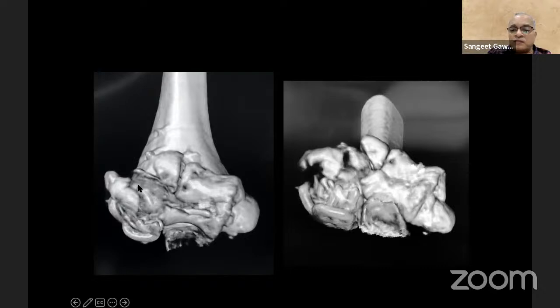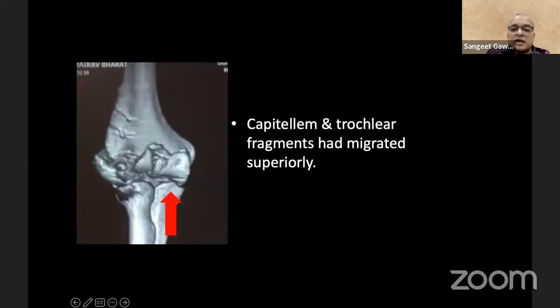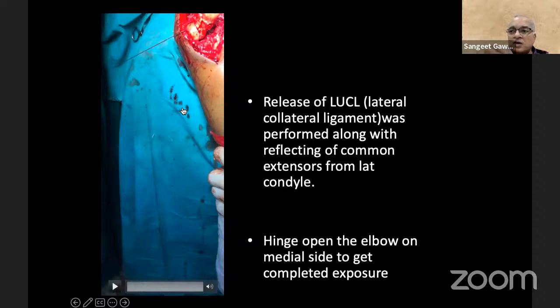Here, we re-explored at 3 months. We took a posterior approach, did an olecranon osteotomy, and even after olecranon osteotomy, the exposure was inadequate. So we completely flexed the elbow. But even with that, it was very difficult to visualize. The capitulum and trochlea fragments had migrated superiorly. Now, when you do an olecranon osteotomy and completely flex in a fresh fracture, you can reduce the trochlea and the capitulum completely and have it fixed from posterior to anterior, as Asim has described. But here, we were not able to see what was happening anteriorly.